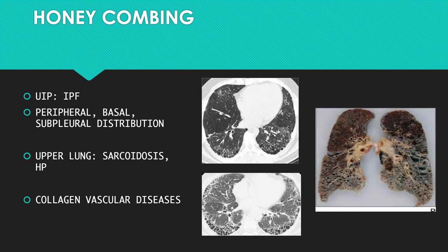Honeycombing is pathognomonic of the UIP pattern in idiopathic pulmonary fibrosis and usually suggests an advanced stage. It starts in the peripheries at the bases in a subpleural distribution. Sometimes it can be in the upper lobes, especially in sarcoidosis or hypersensitivity pneumonitis. It is also seen in collagen vascular diseases. In connective tissue disease–ILD, exuberant honeycombing covering more than two-thirds of the lungs may occur and may abruptly end with a straight line.